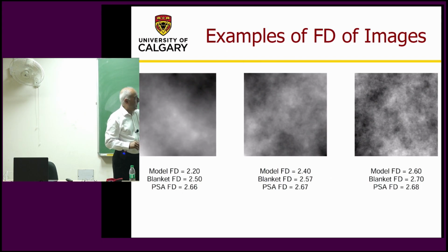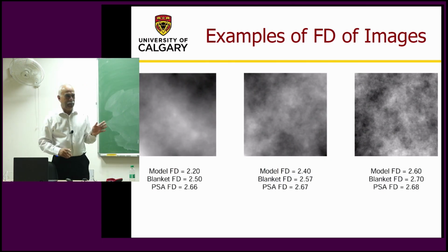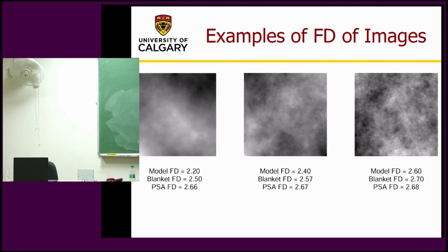This could turn out to be significant from this to this and this to that, or rather from here to there and here to there, maybe not here. But that's not what we wanted to do. One could do such analysis to see if these differences are statistically significant.